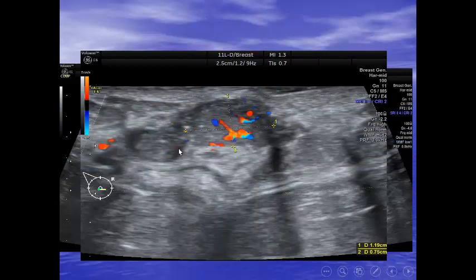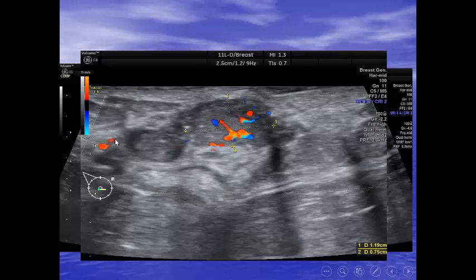This mass shows high vascularity with lack of arborization. Here, this is the inspissated material — it does not show flow. When you apply Doppler, you have to see blood flow in the parenchyma of the breast. When you find blood flow in the parenchyma but no flow in the lesion inside the duct, this is consistent with secretions. But if there is flow — even minimal — this indicates an intraductal solid mass.